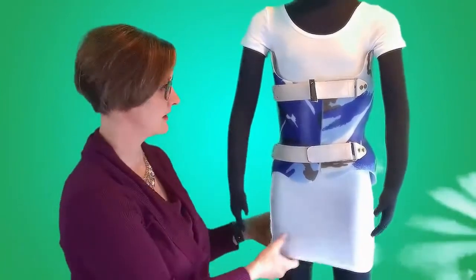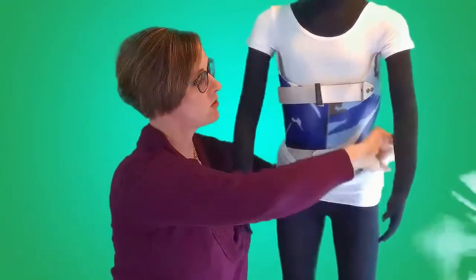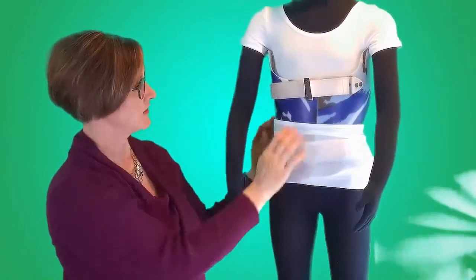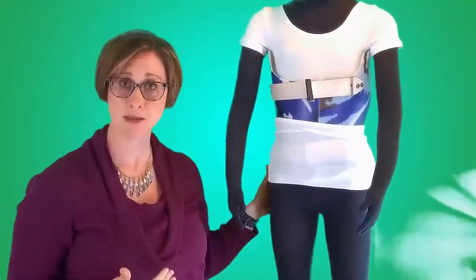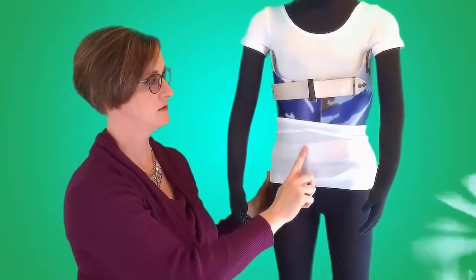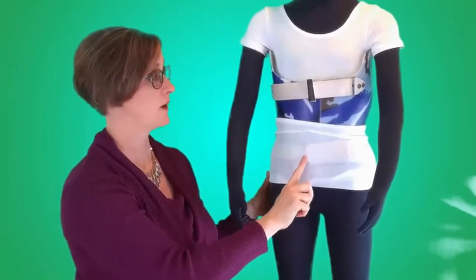One of the most common ways that people like to wear their t-shirt is by wrapping it up and over the bottom of the brace. As you can see, there are a few points here that may be susceptible to forming holes. One is here at this hook and loop tape — the edges of that can be a little bit sharp and over time they can wear on your shirt.